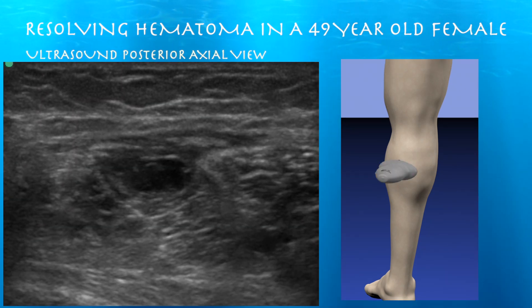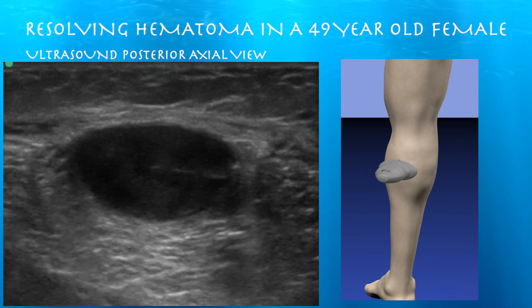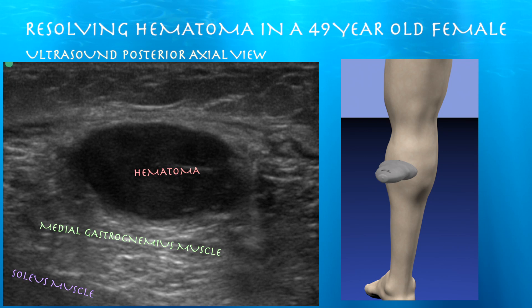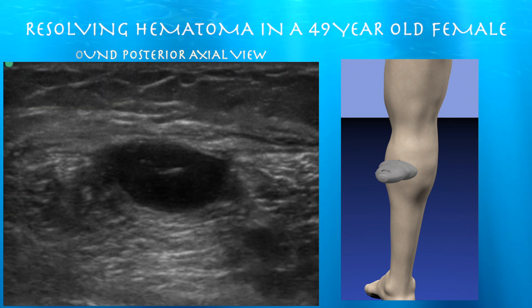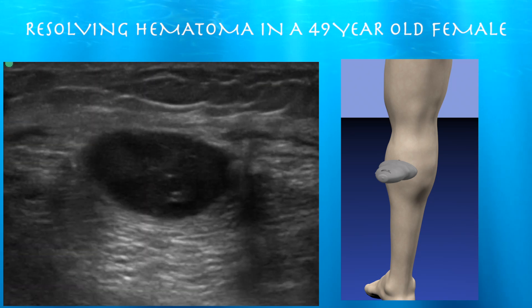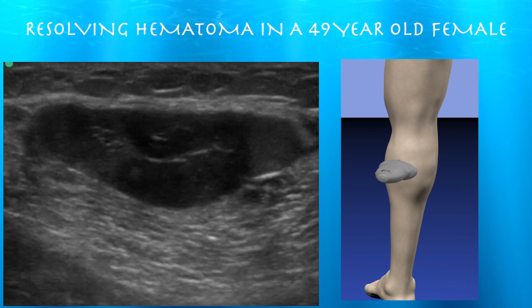Here's an axial image of it. Here's this hematoma — you can see it layers right on top of the medial gastrocnemius muscle, with the underlying soleus muscle beneath it. These chronic hematomas are probably not compressible, so it's hard to judge whether it's fluid or not based on compression.